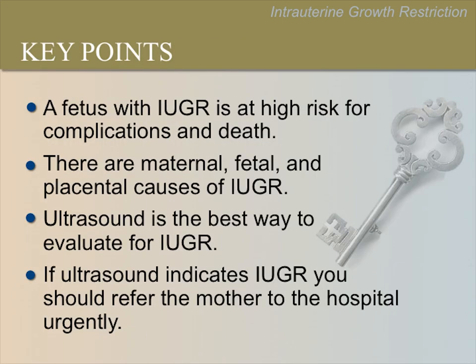Let's review the key points. A fetus with IUGR is at high risk for complications and death. There are maternal, fetal, and placental causes of IUGR. Ultrasound is the best way to evaluate for IUGR. If ultrasound indicates IUGR, you should refer the mother to the hospital urgently.